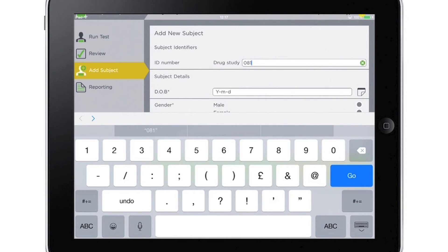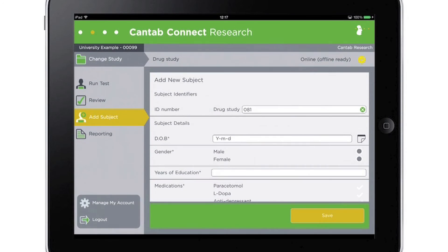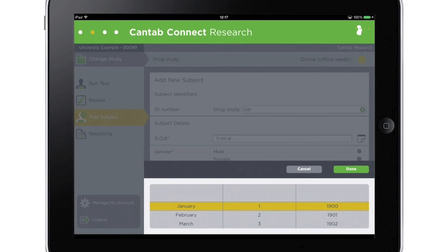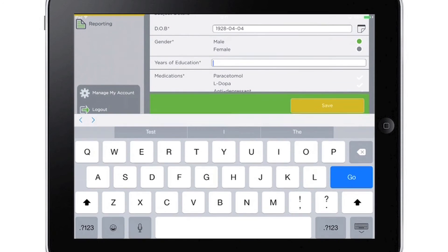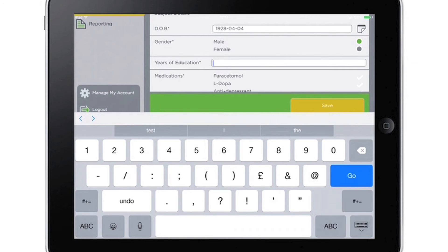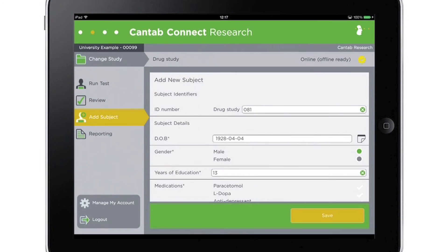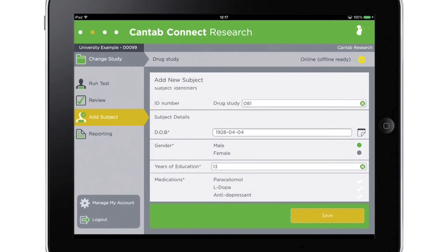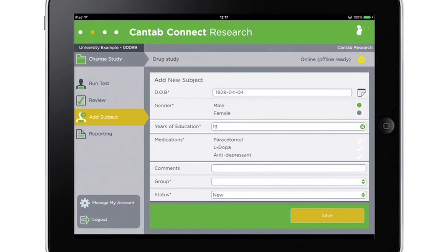Subject information can be configured on a per-study basis. For example, set a study up to select testing language, record date of birth, gender, years of education, medical history, and any other information that is required, and this data will then be collected for every subject in the study.